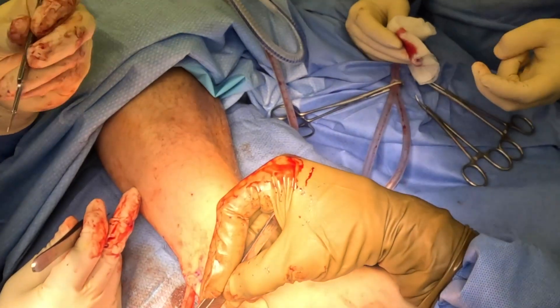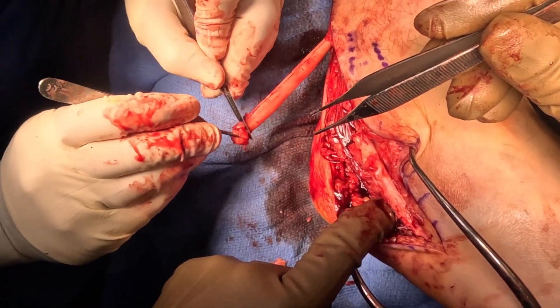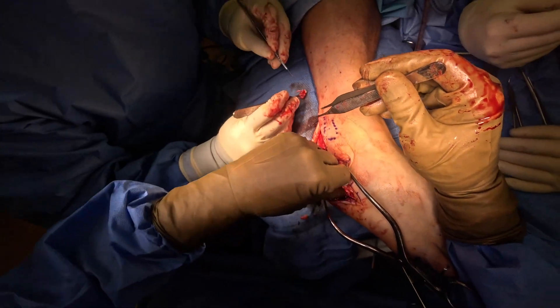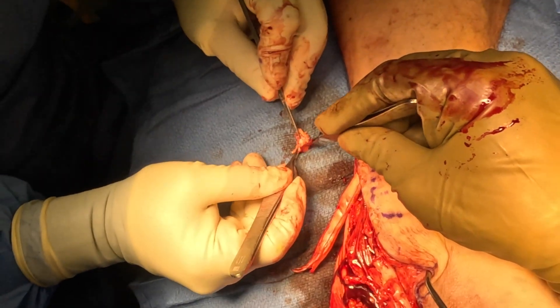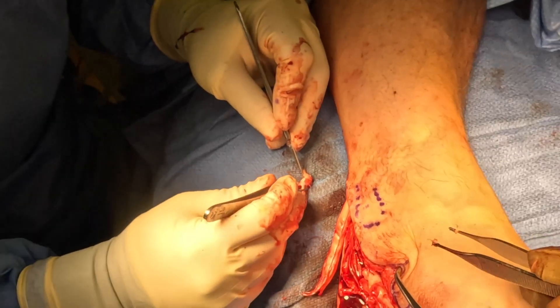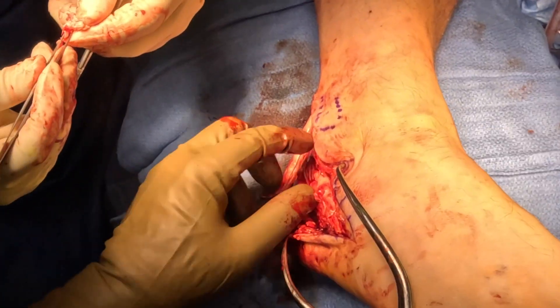You can see we dissected it out and took the bony fragment completely out of the tendon. We'll zoom in here as we're cutting it out — that is a piece of bone that was inside the tendon. It's not floating around loosely; it's actually within the tendon, held in place by the tendon fibers. So if you were to take an x-ray, it would look like it's floating, but it's not. That's the os peroneum — we'll just discard that and tubularize the tendon.